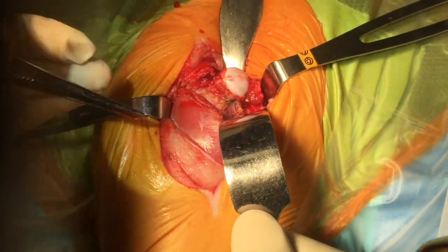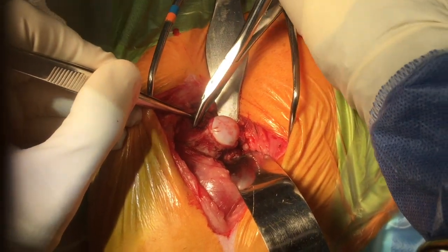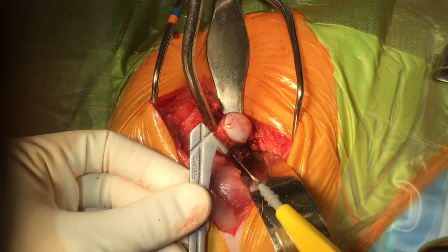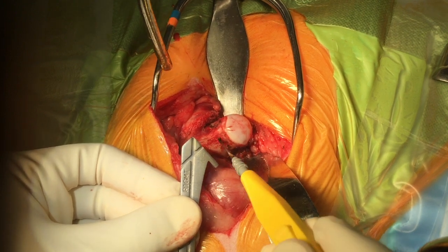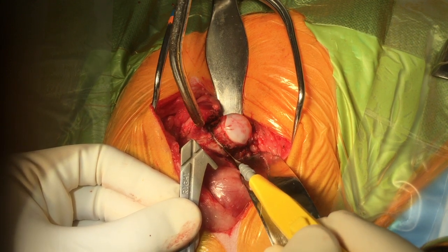A large blunt instrument is placed under the head and neck. A retractor is pulling ventrally on the craniomedial aspect of the proximal femur. The region of the osteotomy is then located with the assistance of a template.